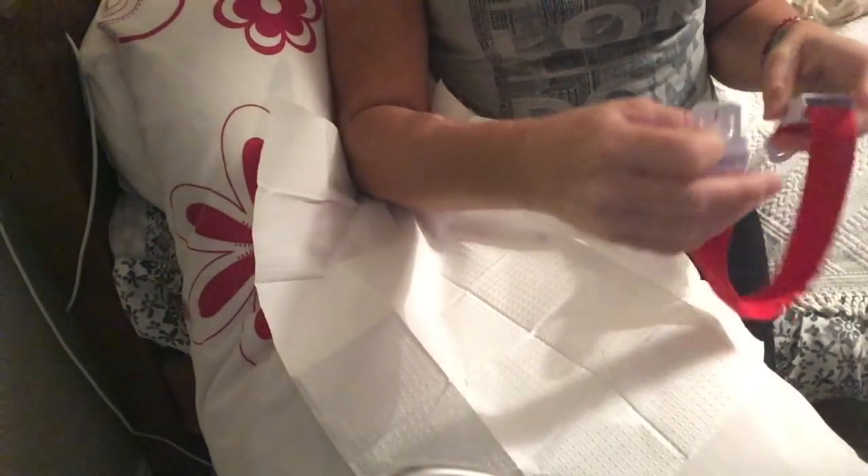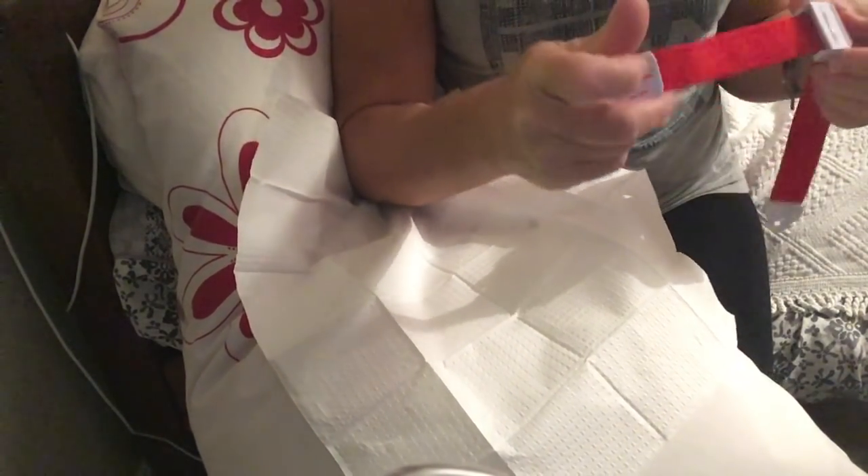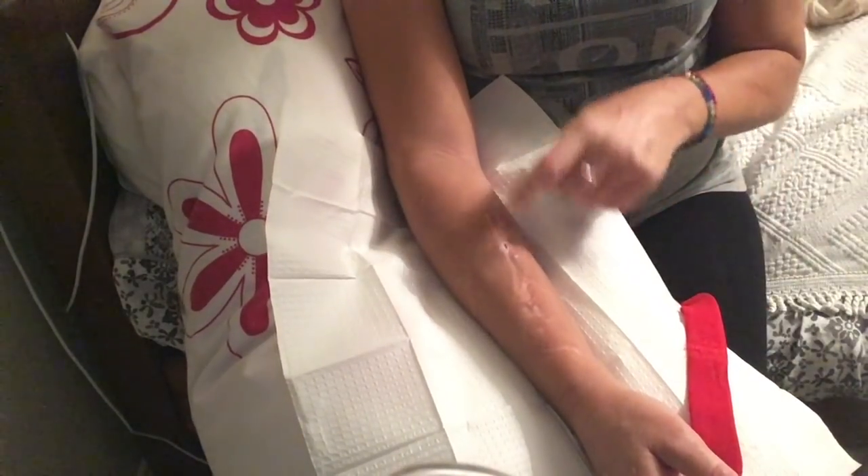This is part two of my dialysis setup — putting the needles in and then connecting up to the machine and starting dialysis treatment. I've already washed my arm and my hands again and taken the scabs off.